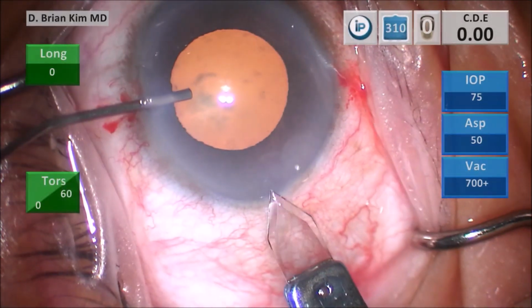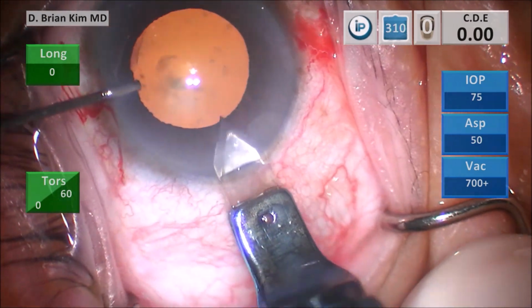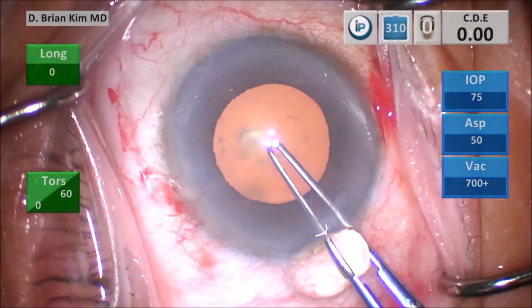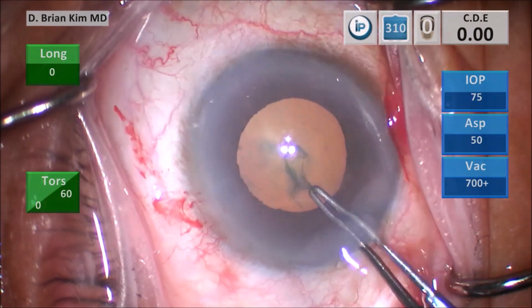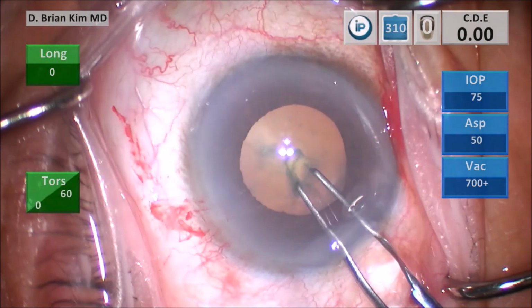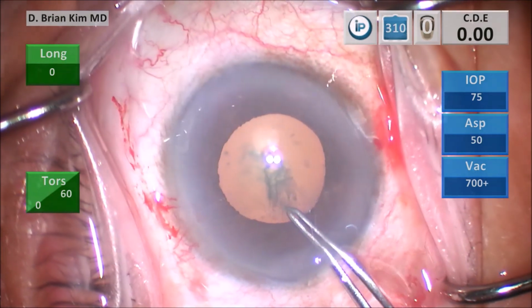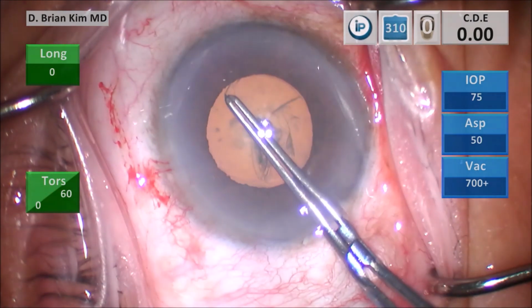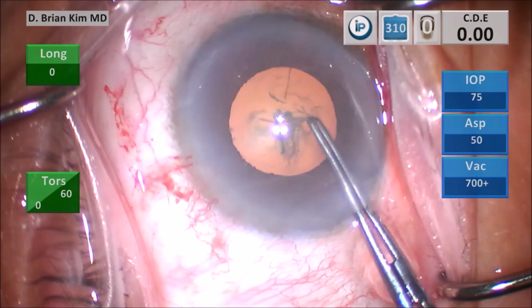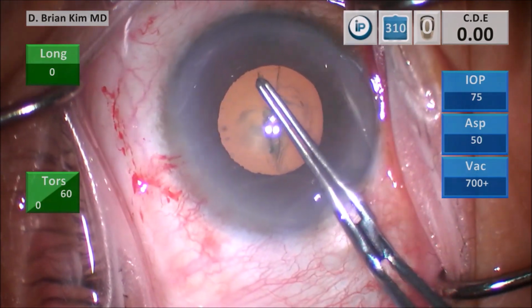I make a vertical groove and then tunnel and then enter the anterior chamber. I use my puncture style capsular rhexis. I make a puncture, pull down, and then sweep a little bit to the right to create a little bit of a flap. Once I get that edge, I grab the edge of the flap and I start going around circumferentially. I'm following the corneal marks, which are going to help me center and size my capsular rhexis. I'm grabbing at the edge and going around as I go.